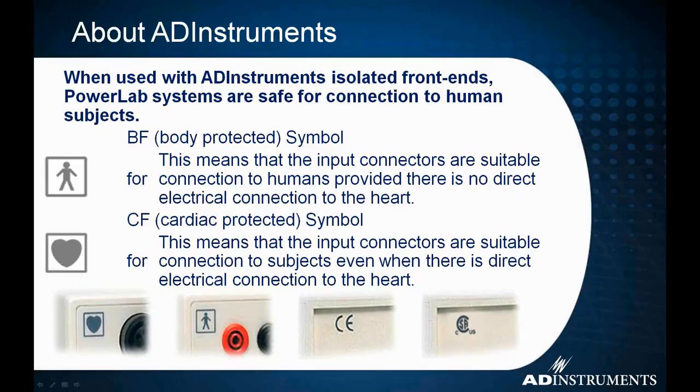As of right now, I think we don't have any cardiac protected devices. If we do, I can't remember if the blood pressure amplifier's approval is still good or if we've updated it, but that would be the only unit that I can think of off the top of my head that would be approved for cardiac protection.